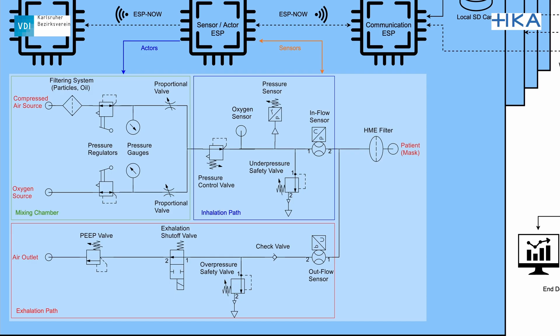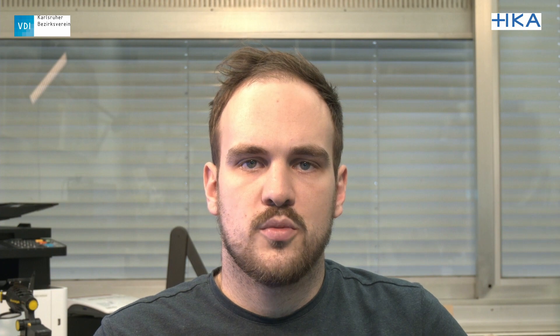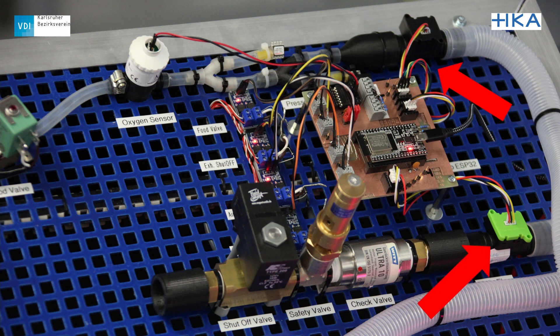There are some more components in our prototype that serve to ensure the safety of the patients. These include the over-pressure valve as well as the under-pressure valve, which allow the patient to cough or breathe in at any time. There is also an alarm controller which monitors the respiration values and functionality of other controllers. Furthermore, two flow sensors are installed for later respiration modes such as assisted ventilation, measuring airflow during inhalation and exhalation.